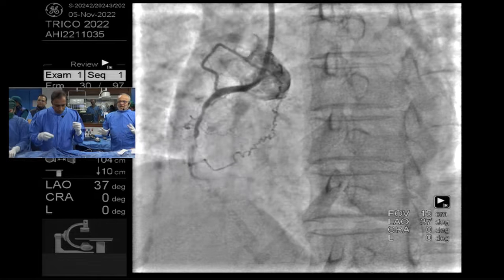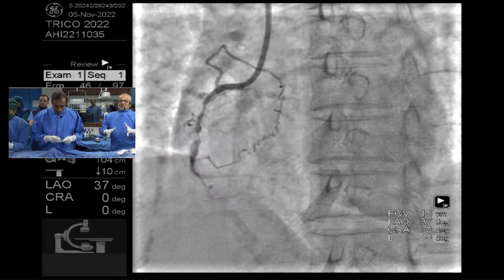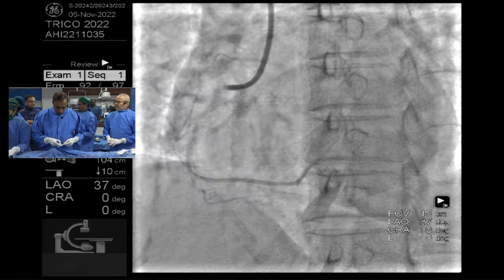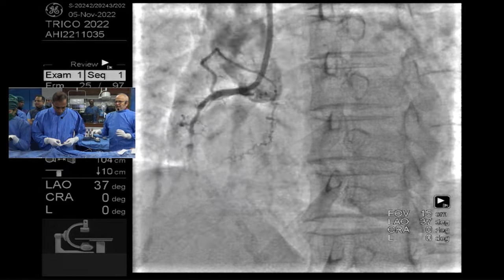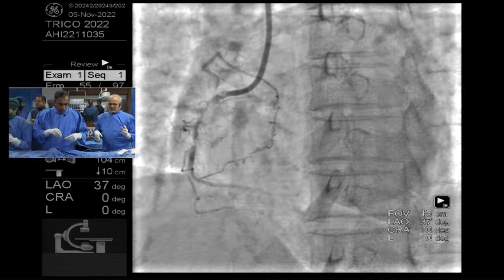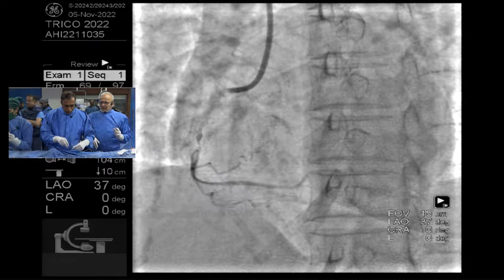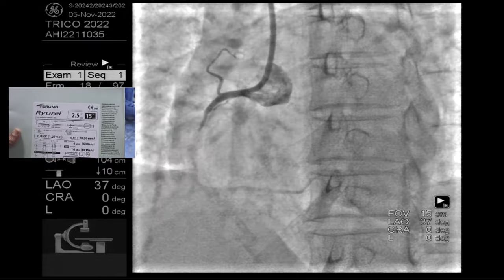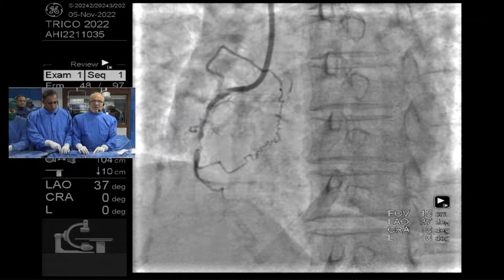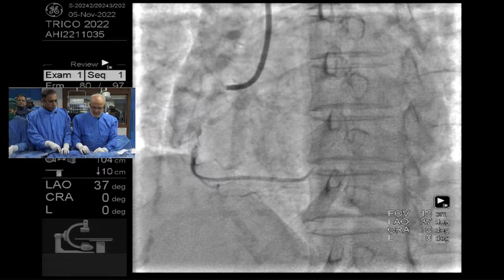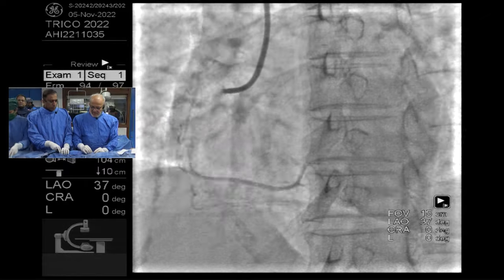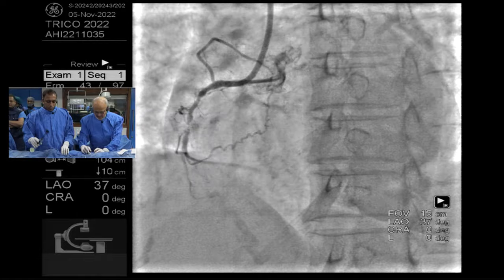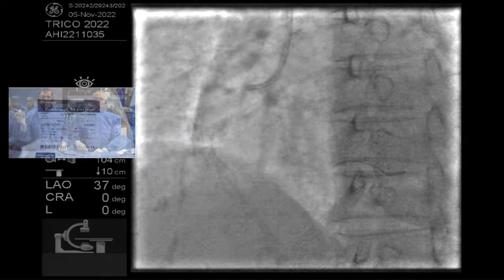Heterogeneous and layered appearance means re-stenosis risk is pretty high. For homogeneous appearance, a Japanese study shows that a sirolimus drug-eluting balloon has given very good results. But regardless, we try to expand them much better first and see how it looks.